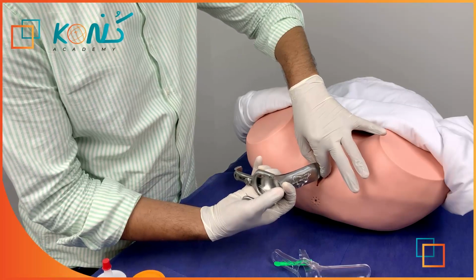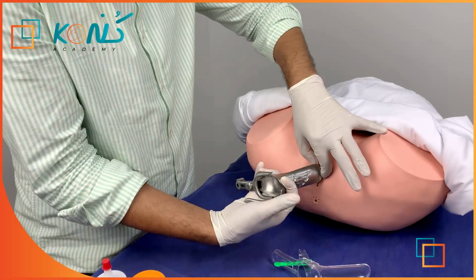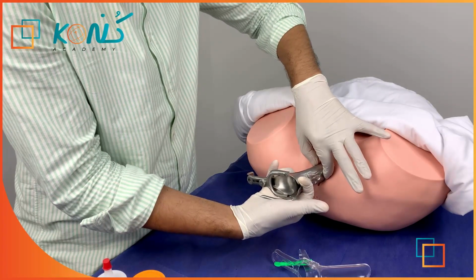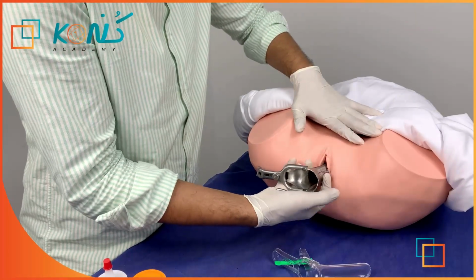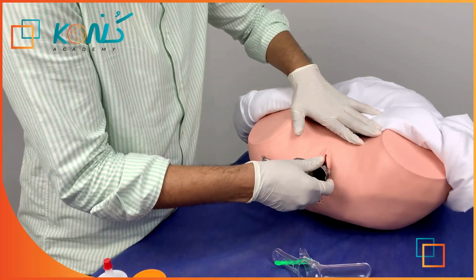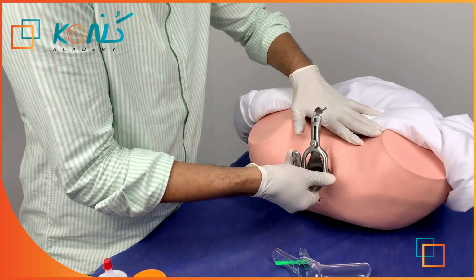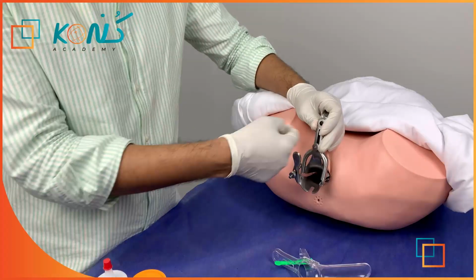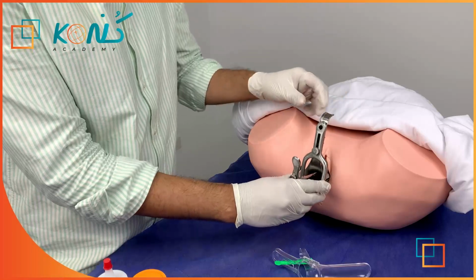Then you will start to put it. We are putting it by side like this. So we are not putting it like this. No, we are inserting it by side like this. Then we are inserting it closed, like this. Then, after inserting it closed, we are rotating it 90 degrees to be like this. Still closed. So right now, I am in. If you want to put it in the opposite direction, to rotate it downward, it will be right. But which is better is to make it like this.